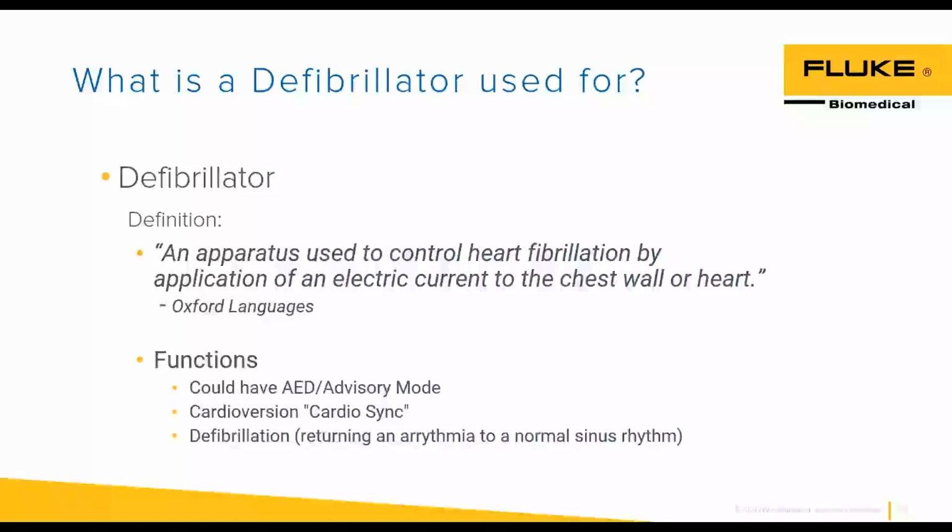Oxford language says a defibrillator is an apparatus used to control heart fibrillation by application of electrical current to the chest wall or heart. Yeah, that means we're getting zapped. That's how we're going to treat the patient.